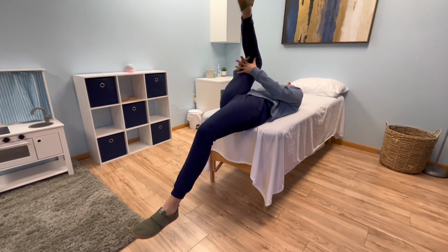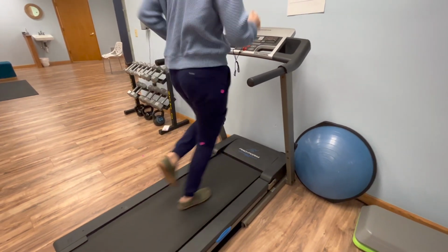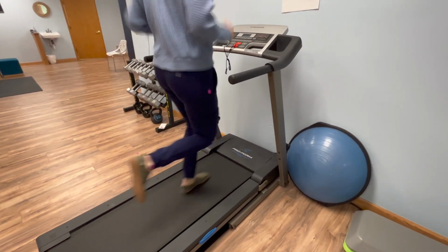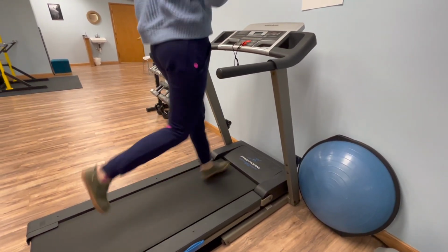Strength and coordination testing allow us to focus on various regions during the video analysis. We'll test the ability of your muscles to contract quickly and take on load during running, which can be close to 3 times your body weight. We'll assess your stride length and your running cadence and compare this with the slow motion footage to determine areas where you might be inefficient in your running. We'll slow down the video using a software, and we can assess the angles at your joints when you're landing and when you're propelling forwards.